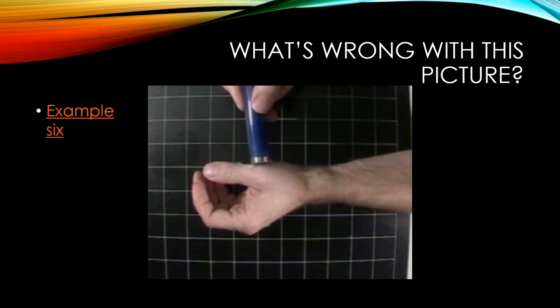A sixth example with a 1 cm² ERA sound head shows coverage of too large an area, the sound head becoming uncoupled — you can see the dark surface of the head coming off the skin — and some tilting. The 1 cm² sound head is appropriate for the thumb metacarpophalangeal joint, but the technique shown is not good.